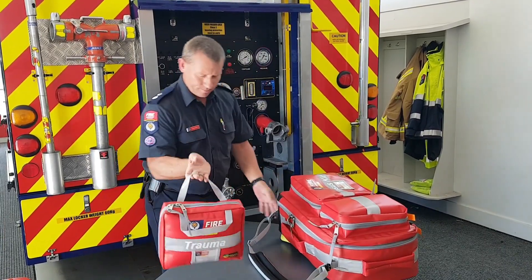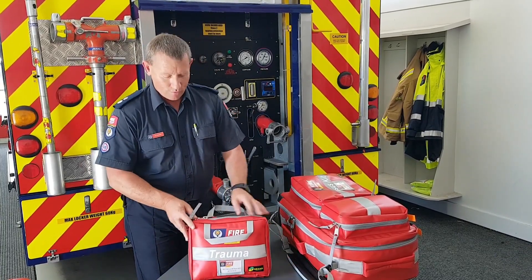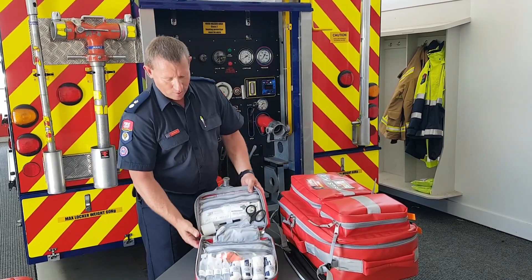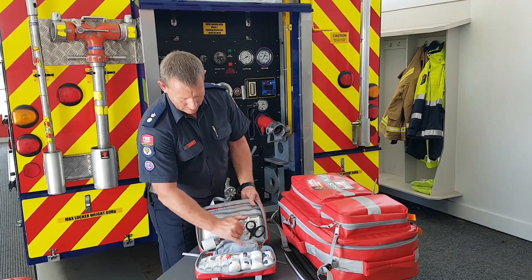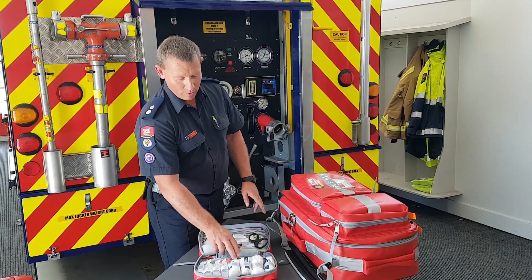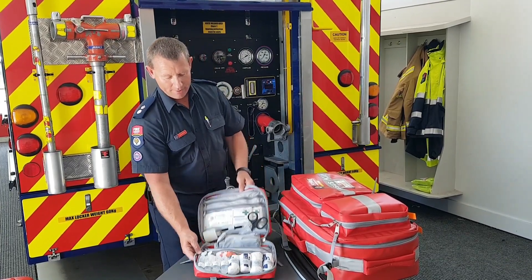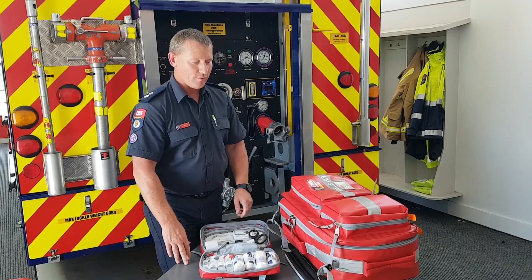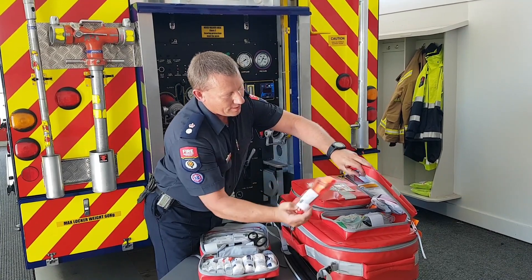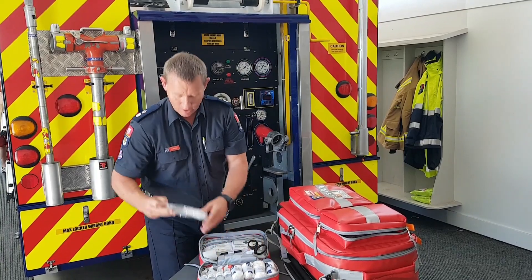So that is our little beastie here. The idea was to develop a kit where you didn't have to rummage through and find bits and pieces, so everything in here should be easy to find. When you unfold it, the contents are actually listed and you can read exactly what goes where. There is one slight anomaly: there is only one CAT tourniquet carried in the trauma pouch, and the prime reason for that is it's too tight to fit two in there. So for quick access the second CAT tourniquet is placed in the lid of this compartment. Tucked away in here we've also got our ring cutter as well.